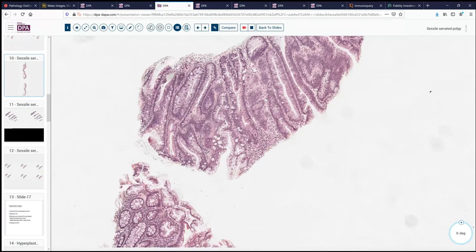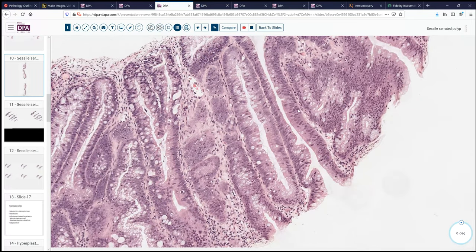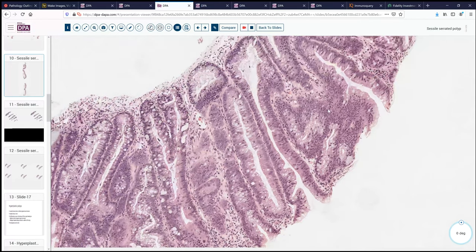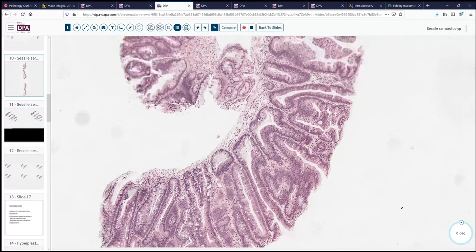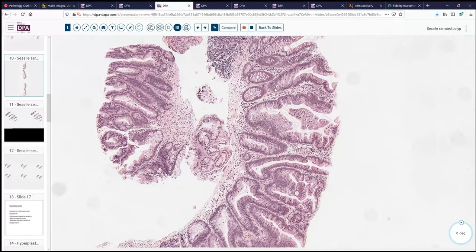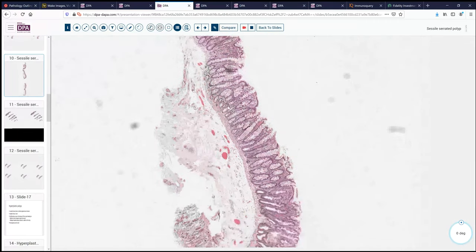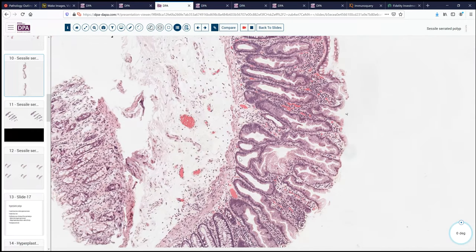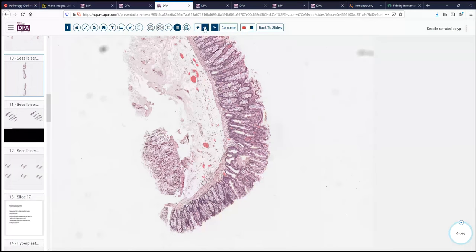We note here that there begin to be a few areas where the mucin goblet cells are decreased. This may be an area of beginning dysplasia, with some piling up of the nuclei — a feature we can see in these serrated lesions. Here we see the glands sort of bifurcating and dilating in the deep portions. These dilated deep glands may be fairly localized. Right here, we have several glands that are slightly dilated and more complex in the base, and that is sufficient in the appropriate setting to make the diagnosis of a serrated adenoma or lesion.